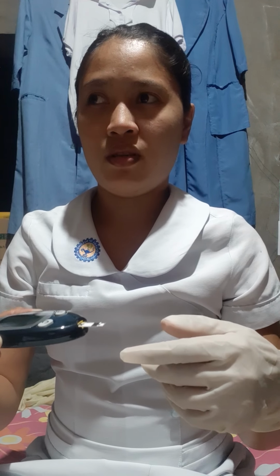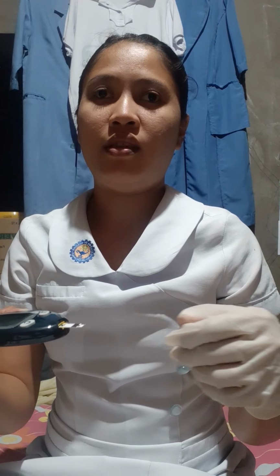So it looks like that. If the blood is already there, it shows the blood. It will measure immediately after we put it there.